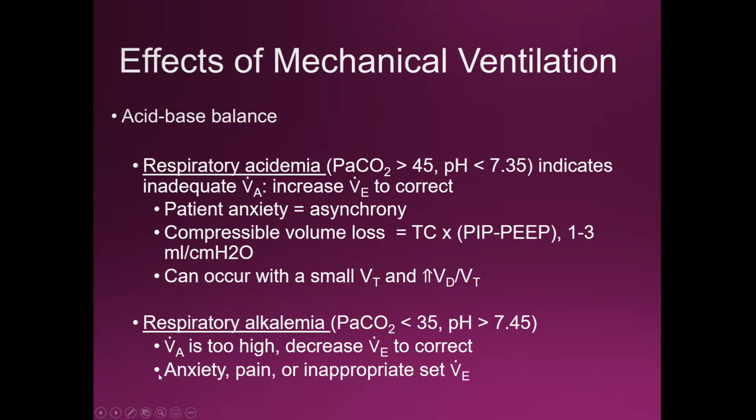Now, why? It could be anxiety. It could be pain. It could be an inappropriate setting of your minute ventilation, or it could be because you are not oxygenating really well.